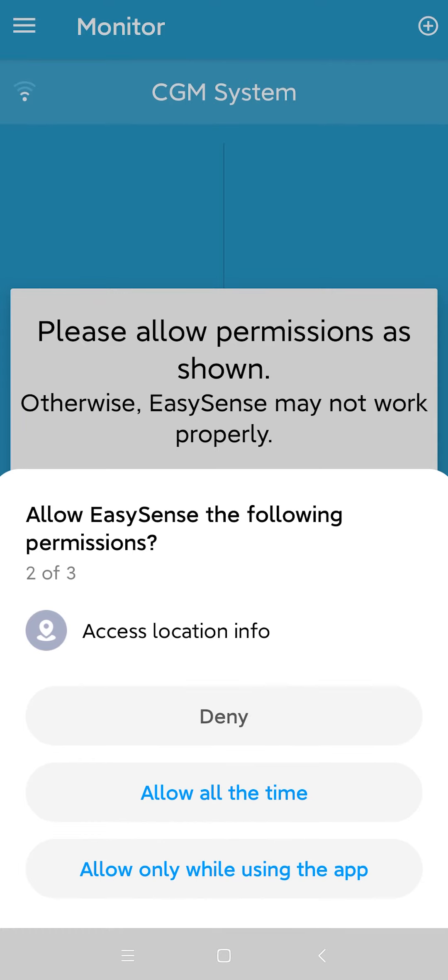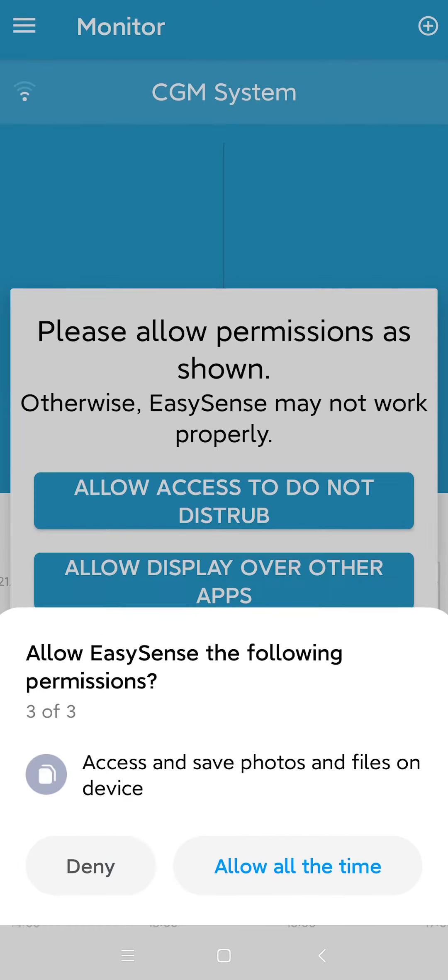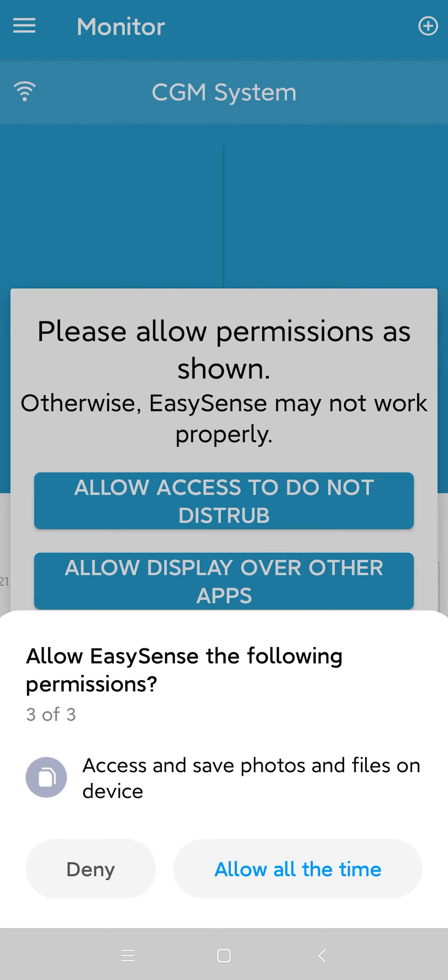Repeat the previous step two more times to allow the app to access your location and files on your smart device.